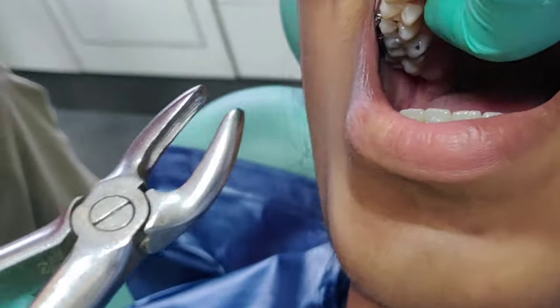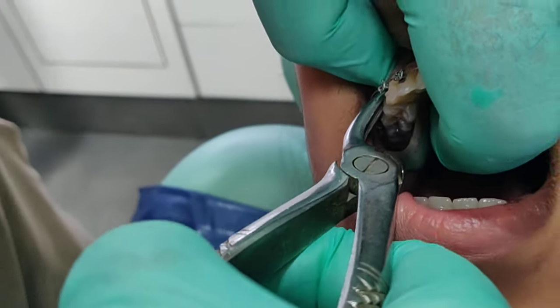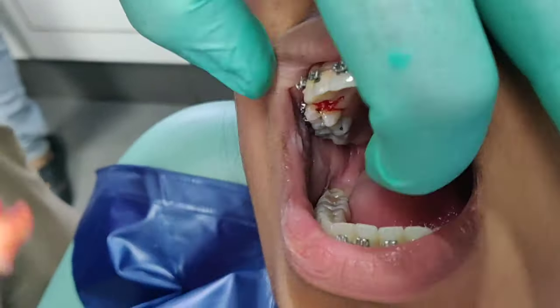We are going to do orthodontic extraction, just rocking the tooth. As you can see, we have to give just gentle motions, and the tooth is out.